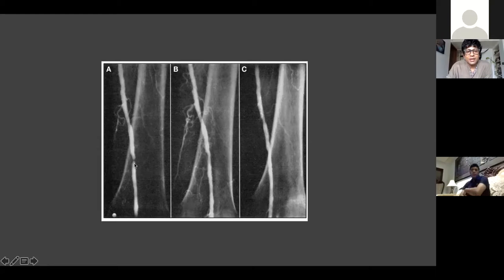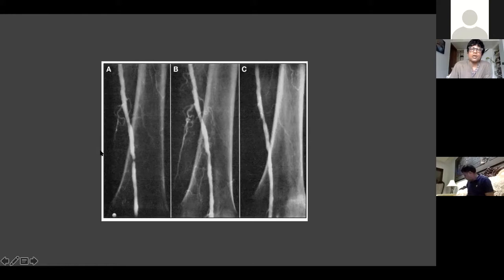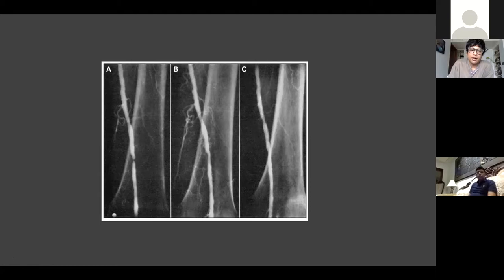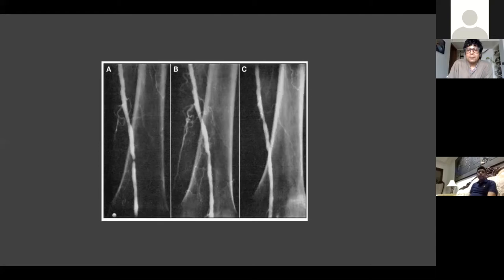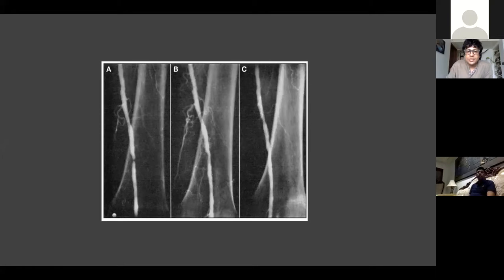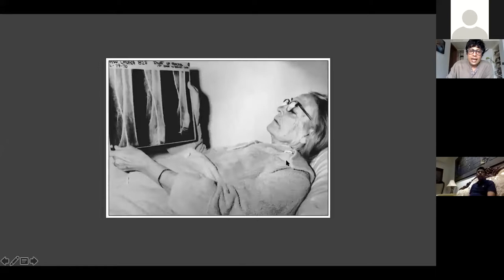You can see there's practically a CTO or a very thread-like lumen in the superficial femoral artery, which was dilated progressively. The method Dotter used was to cross the lesion on a guide wire, then perform serial progressive dilatation of the femoral artery. This wasn't called angioplasty at this stage - it was just called 'dottering,' because he hadn't coined the terms dilatation or angioplasty.